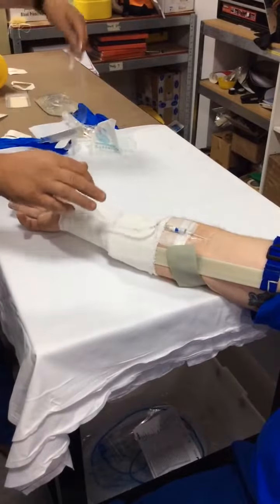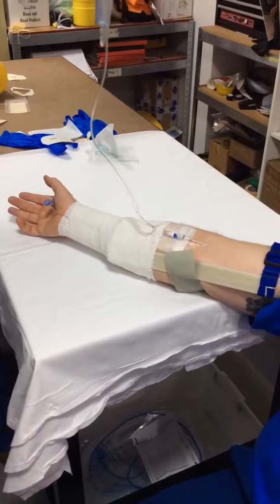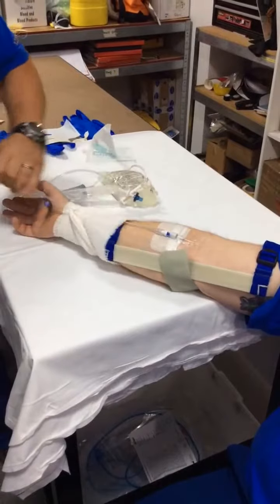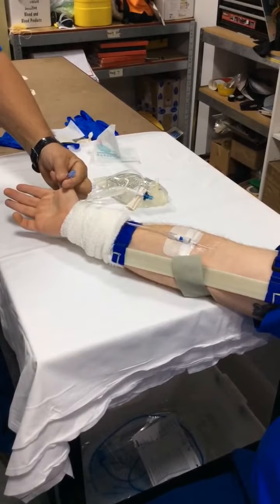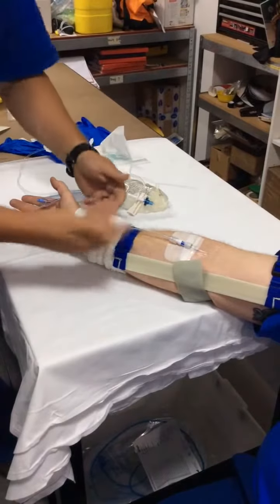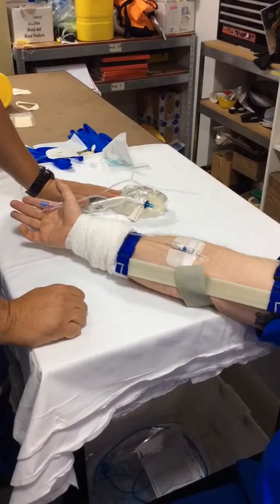Traction on this — whether from inadvertently getting it caught on something or otherwise — will not result in the IV access being dislodged. We'll test it now. You can see the line will snap before the IV access is pulled out, so you've still got IV access. In the worst case scenario, you can disconnect it and secure another pump set to it.